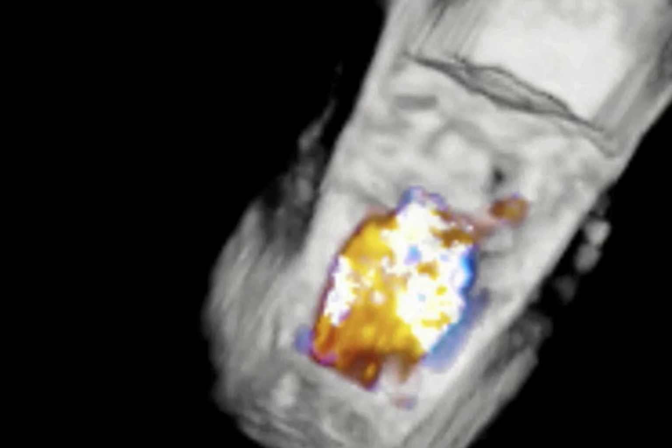That is actually, you were spot on in this case, and this is something that bothered me the most also. It seemed like this is not the only source of regurgitation, as there is the coaptation defect between the anterior and posterior leaflet, and what seemed like a perforation. Now, the important thing is that in three-dimensional imaging, sometimes dropout artifacts can mimic perforations, and particularly when you incorporate color flow Doppler information, the underlying color flow can mimic a perforation. So this was quite integral information that confounded us, and we had to square this out to figure out whether this was an actual perforation or just a dropout.